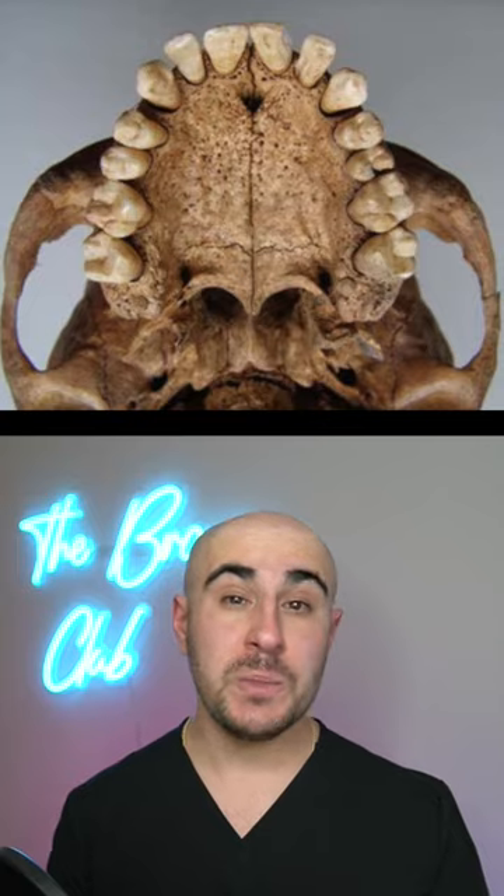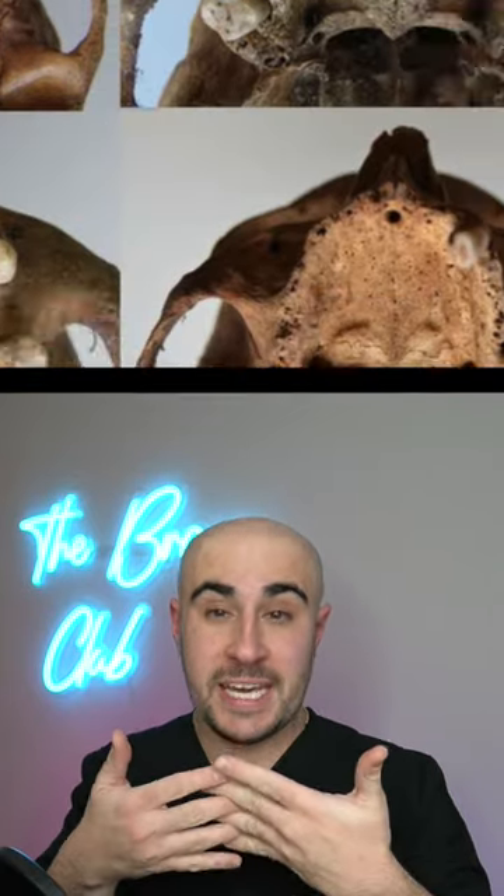When we're younger, the upper jaw is actually two bones. And as we get older and older, it starts to interdigitate like a zipper, making it harder and harder to expand. That's why expanders are best done when you're younger. But don't worry, there are alternatives if you are older.